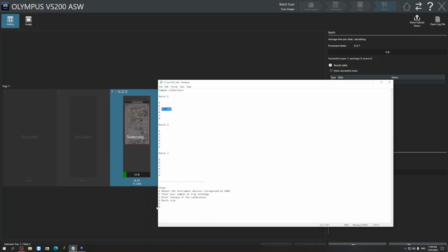We have set up batch scan in step 4, and step 5 is going to be uploading to the database, and then optional downloading to local PC, and step 6 is producing set stack.